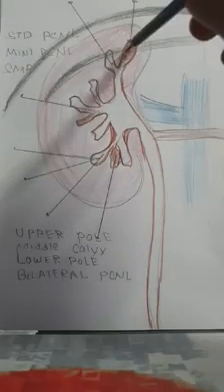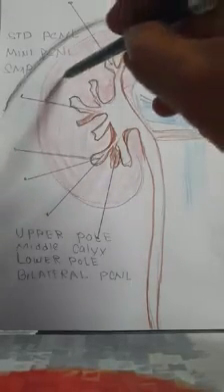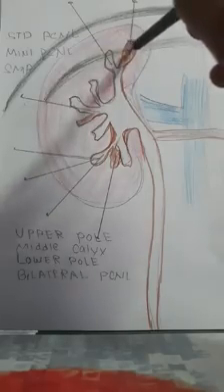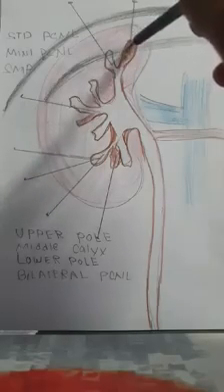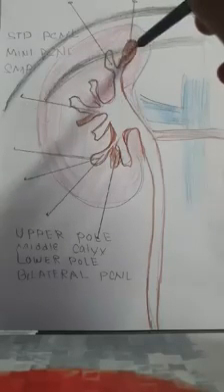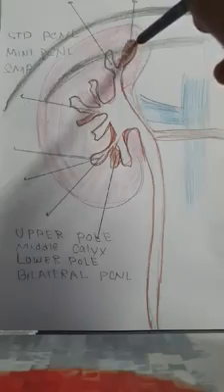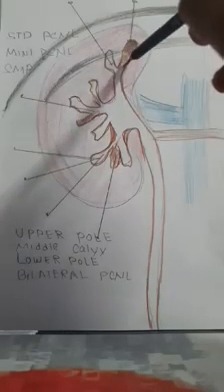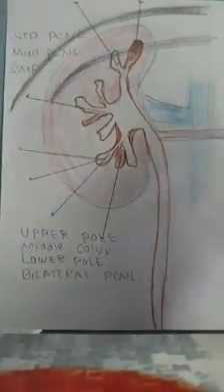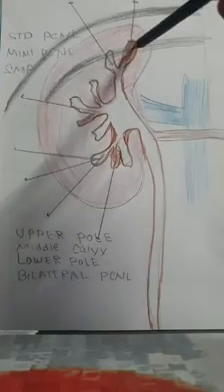It's a very straightforward puncture, and the problem here is always the 12th rib, which is always between you and your calyces. Sometimes the 12th rib is exactly in the same plane, sometimes the calyces are a little higher, sometimes a little lower. So sometimes you have to ask your anesthetist to hold the breath, and sometimes give expiration or inspiration.